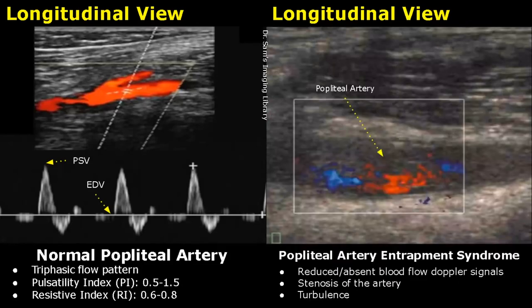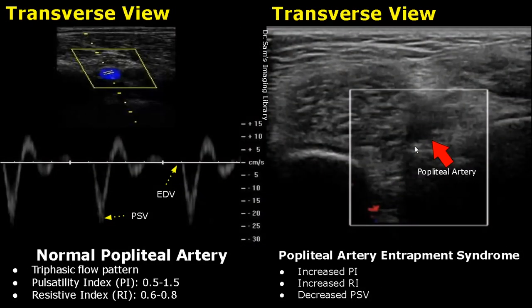Popliteal artery entrapment syndrome usually occurs in athletes who have hypertrophic leg muscles. In this condition, reduced or absent blood flow is seen in the vessel, stenosis of the artery is also seen, and we will also find turbulence. Here is a transverse view of the popliteal artery — we do not find any Doppler signals. We will also find increased pulsatility index, increased resistive index, and decreased peak systolic velocity.